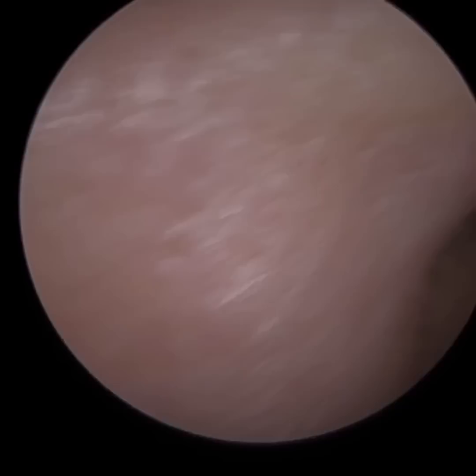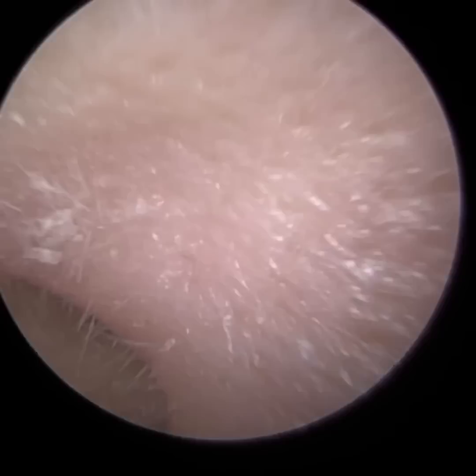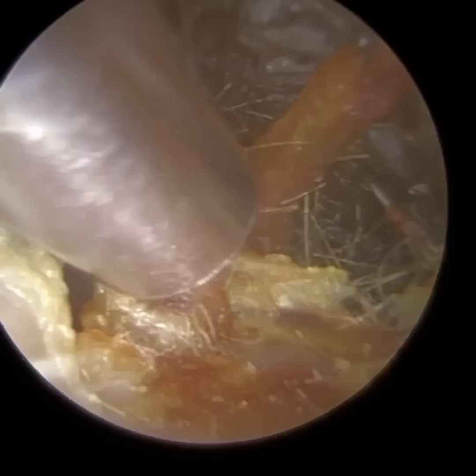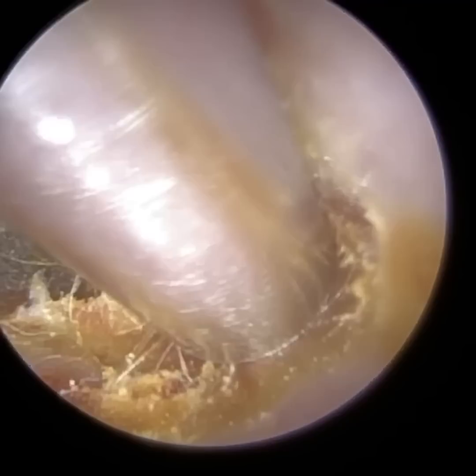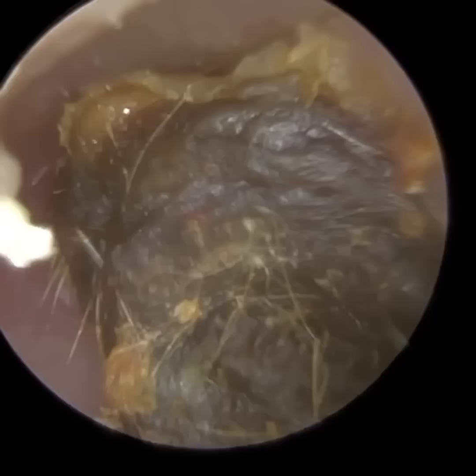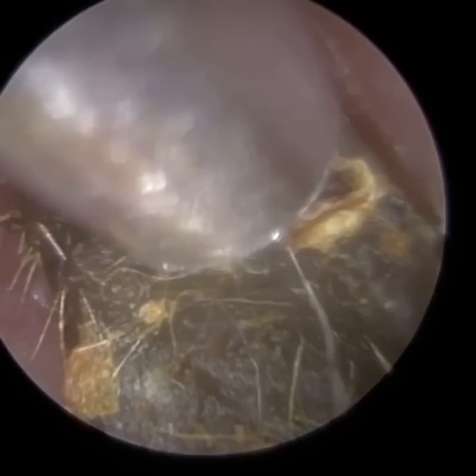This is patient two. Similarly, they had used a cotton bud, and again you can see in the middle the indentation left by the cotton bud — it's really impacted. This is their left ear. The patient has got a bit of exostosis, some bony bumps in the ear canal. It's always important when performing ear wax removal to examine both ears, even if only one is blocked, because it may give you clues about the ear anatomy on the other side. Each ear can have a unique shape, but it gives you understanding of what the blocked ear canal anatomy is like — so something to watch out for with that exostosis and those bony spurs.